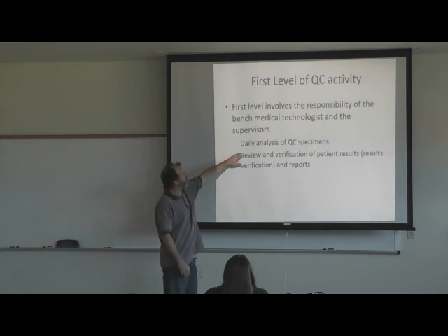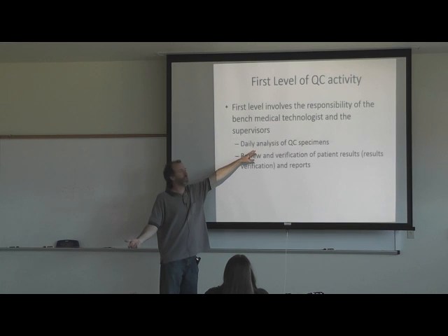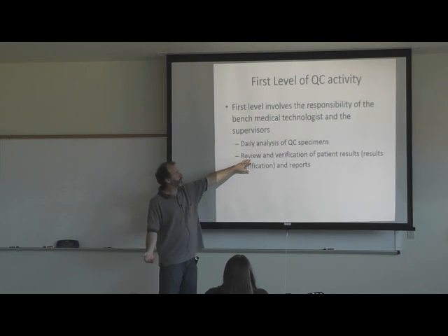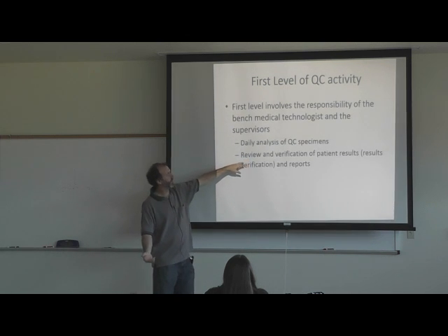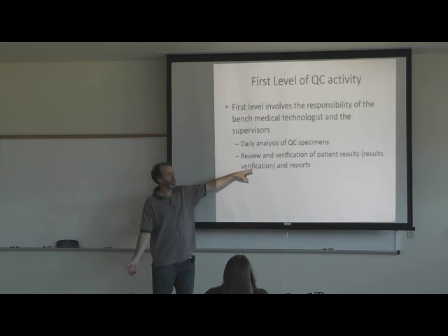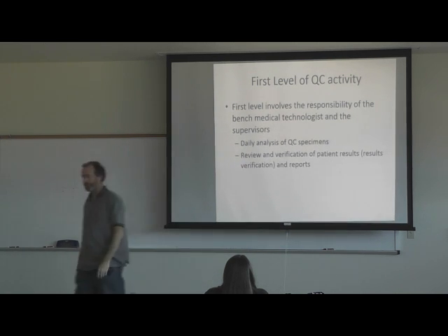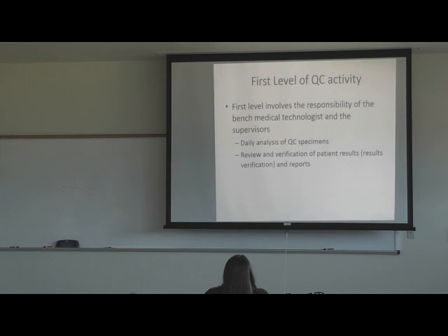So basically, the responsibility: you have this daily analysis of quality control specimens, and then you review and verify patient results as another way. So daily QC, and then you look at the patient results and review and verify those reports, right? We'll get into it in a little bit.